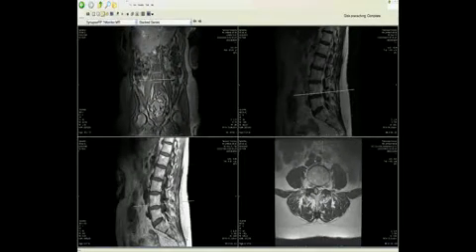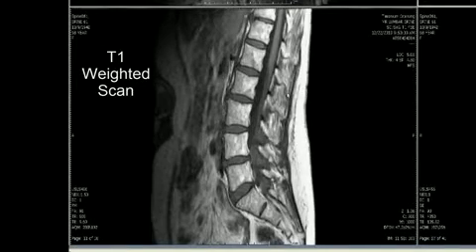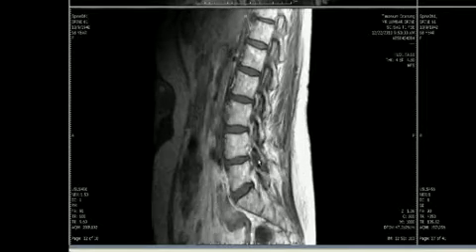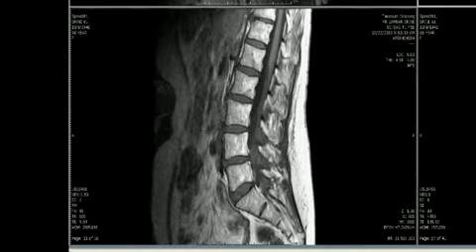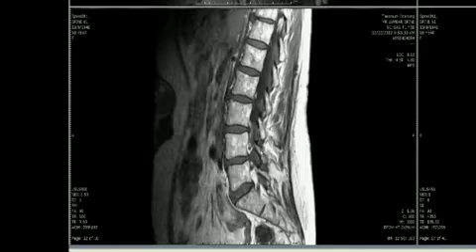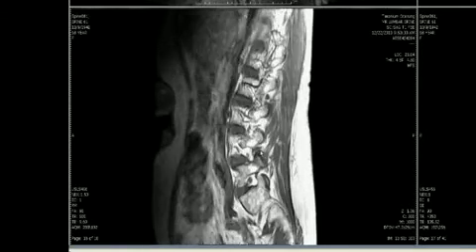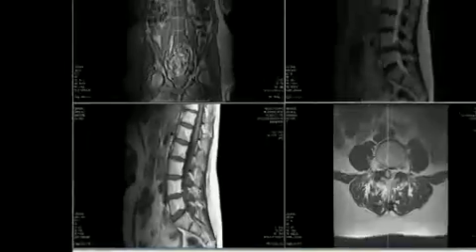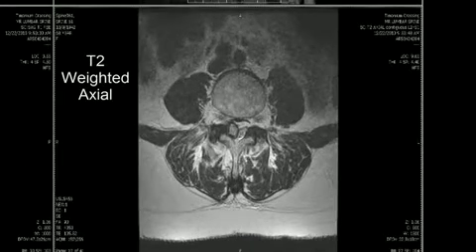Looking at the T1-weighted scan, we're not able to see the mass very well at the L4-5 level, but it does not have the same signal intensity as the cerebrospinal fluid. It is once again localized to the right of midline, as we see scrolling from the midline to the right side. At this point we should go to the axial scans.